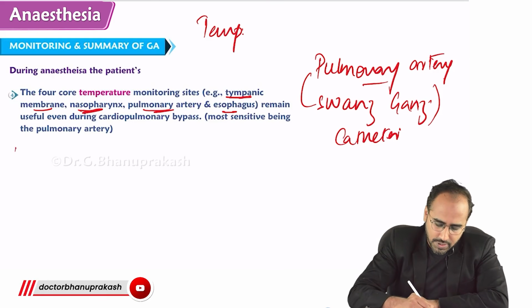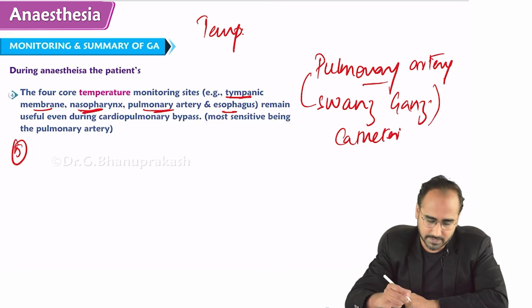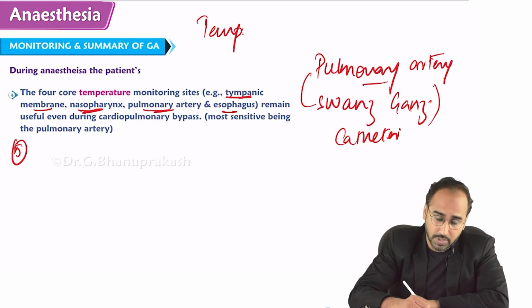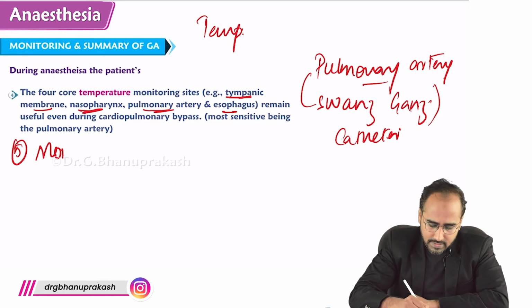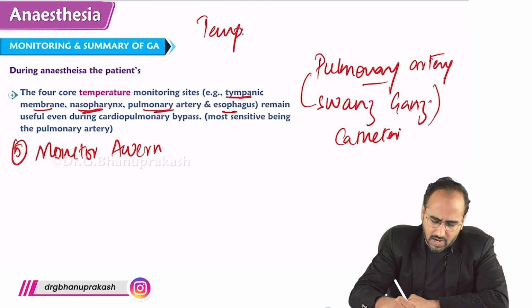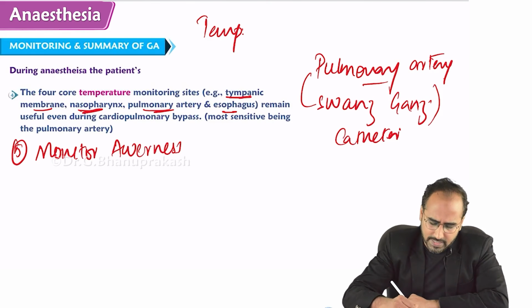Apart from that, you also monitor the awareness. How will you monitor the awareness during anesthesia?